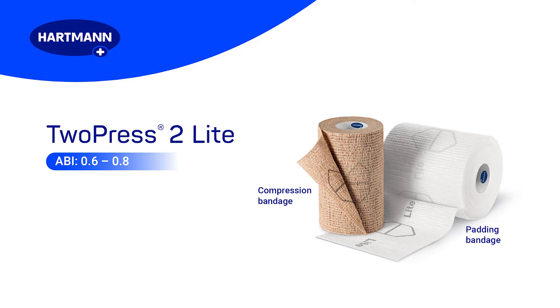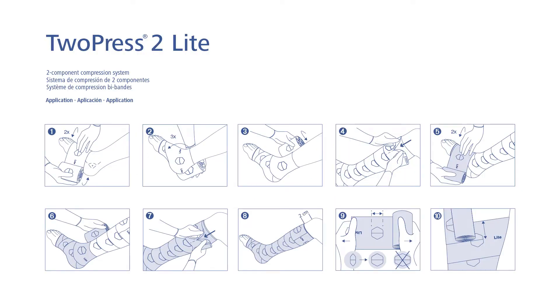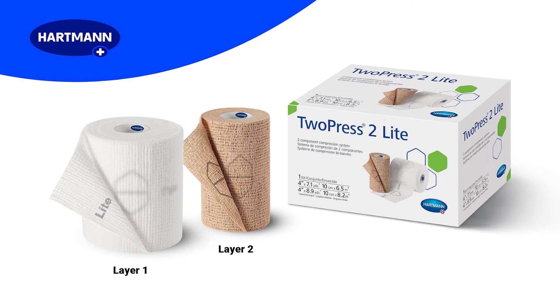It is suitable for patients with an ankle brachial pressure index of 0.6 to 0.8. For a full list of indications and contraindications, please consult the instructions for use, which are included in each kit. The bandages are individually wrapped and labeled as layers 1 and 2. Please use the system as a set and in the correct order.